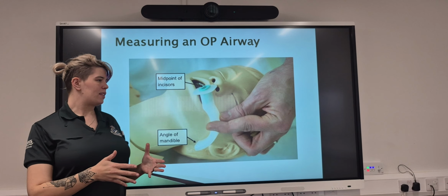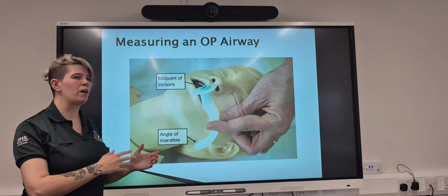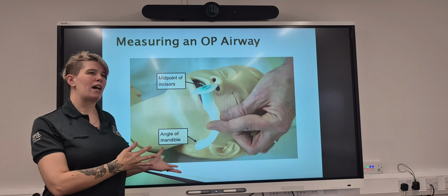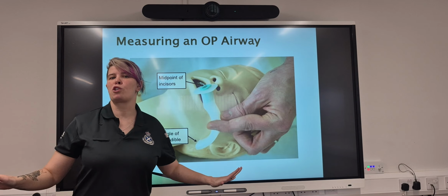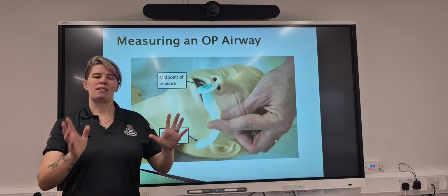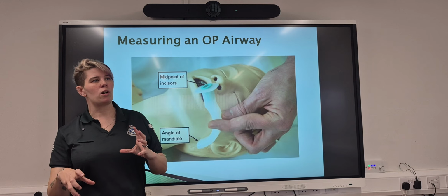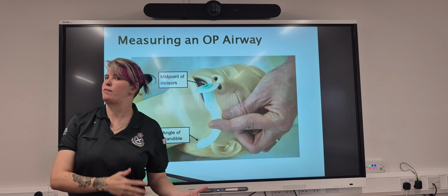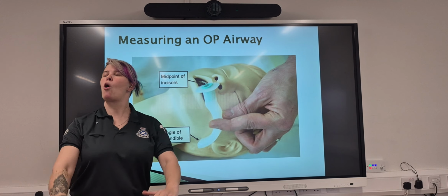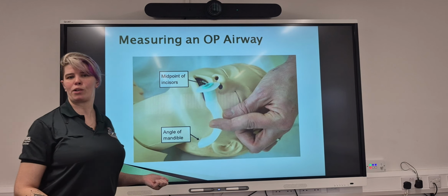What is important is to reassess. Every time you do something to the airway, reassess it, because there is no point in inserting an OP and just accepting that it's gospel, it works. It doesn't work like that. So put your OP in now. Does that feel better? Yes, it does, or not quite sure about that. If they vomited, these situations are interchangeable. So constantly reassess and adjust if you require.